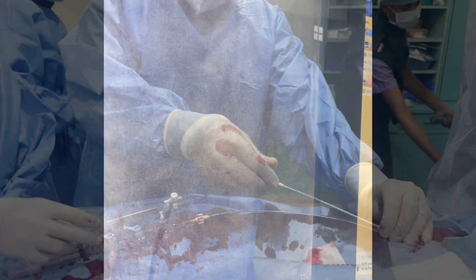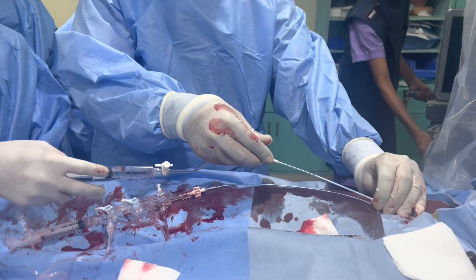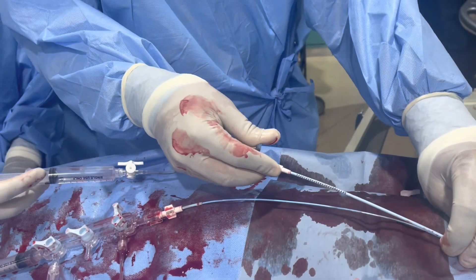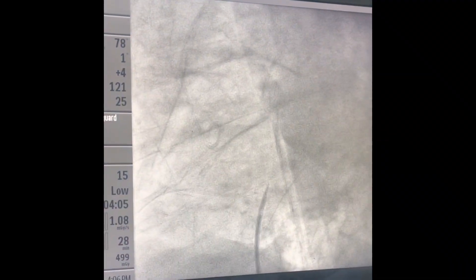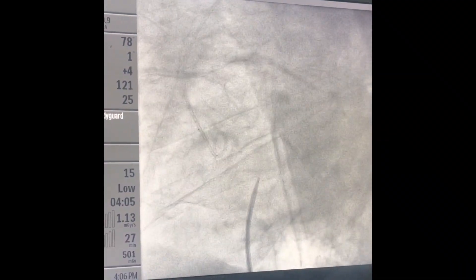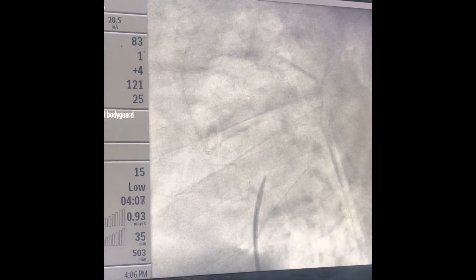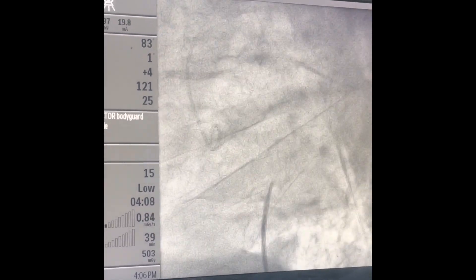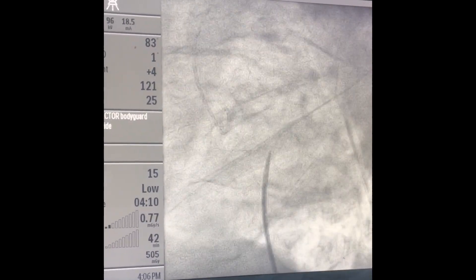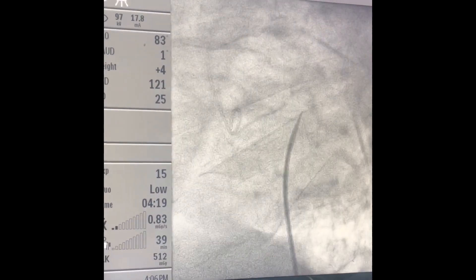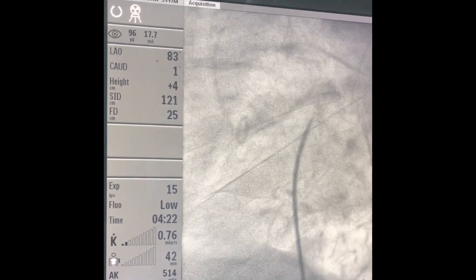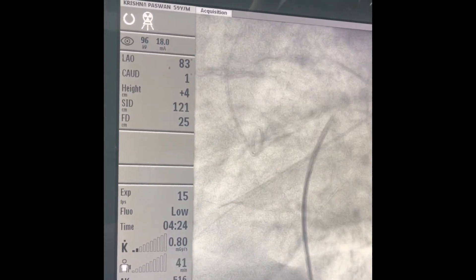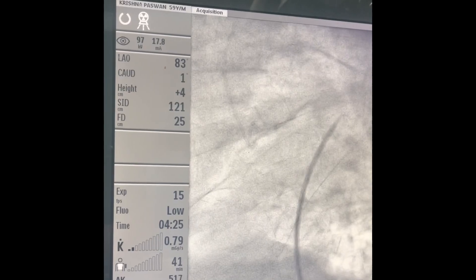The hub is now pointing towards six o'clock position. Posteriorly — not lateral, posteriorly — towards the spine. It is usually dilated right. Now give some contrast. It has gone there — now advance the dilator.